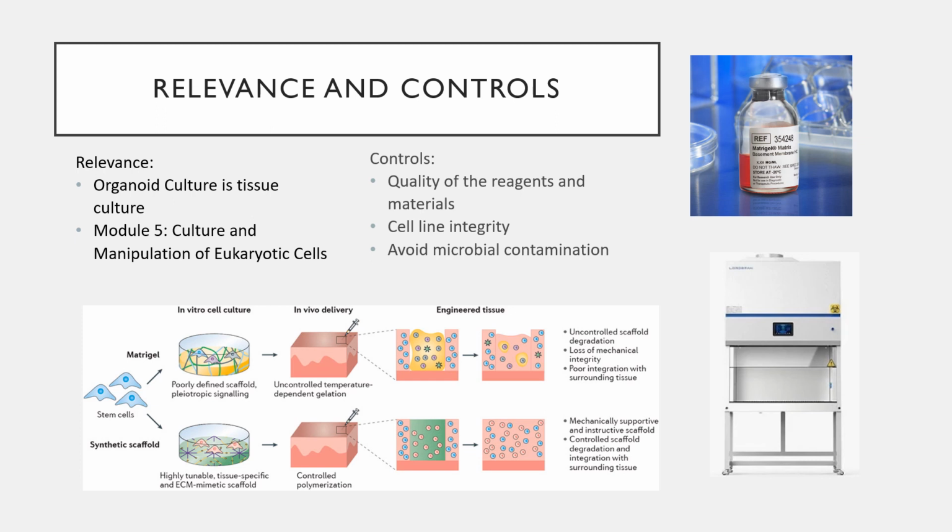You can send the organoid samples out for pathogen testing if you are purchasing them rather than creating them in-house. Avoid microbial contamination by using good tissue culture techniques. Perform procedures in a biosafety cabinet. Make sure that the extracellular matrix is not contaminated. If possible, send that out for pathogen testing as well.